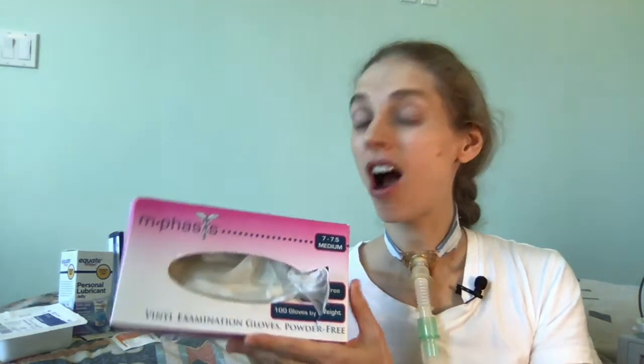This is also important because your tracheostomy tube is very flexible. So once the obturator is in place, like this, it keeps it very rigid, so when it goes into place, it won't get caught in anything. The obturator is very, very important, and please do not try to put the tracheostomy tube into place without the obturator. The next item I highly recommend for the tracheostomy tube exchange are gloves.